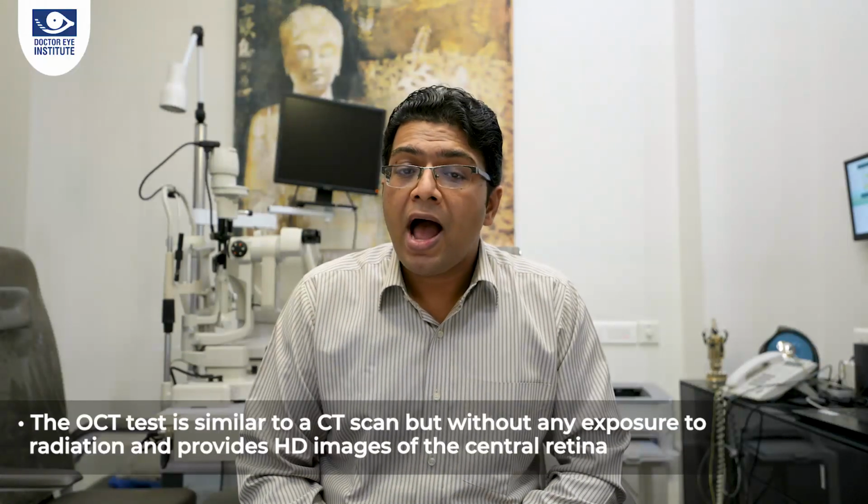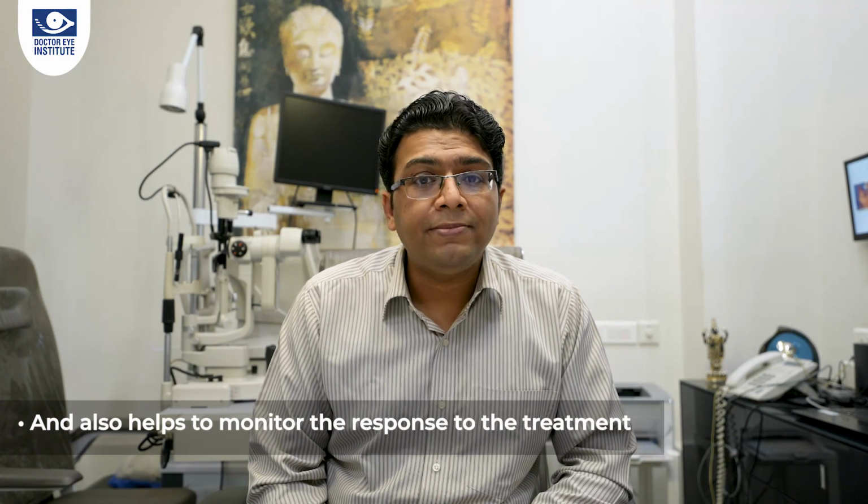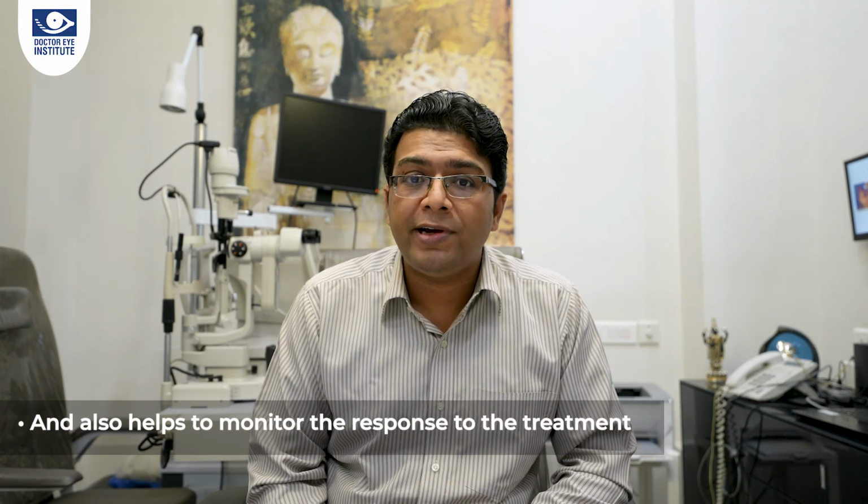It provides high-definition images of the central retina with a resolution of about 10 microns, which is about 1/100th of a millimeter. The machine performs nearly 70,000 scans in a second and can complete the image of the central retina in less than 2 seconds. Moreover, it also helps to monitor the response to treatment.